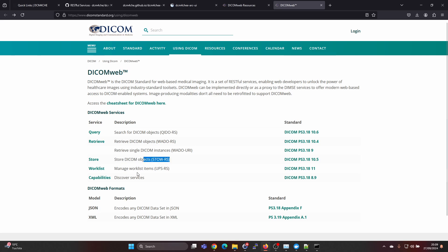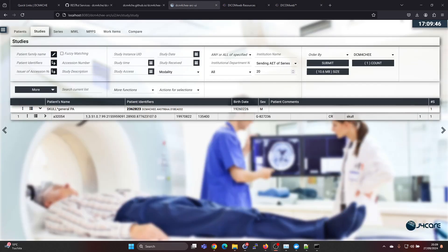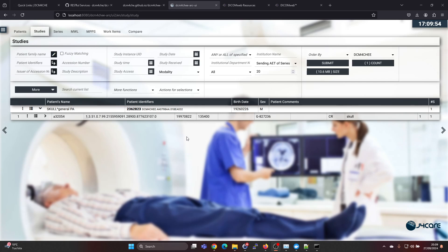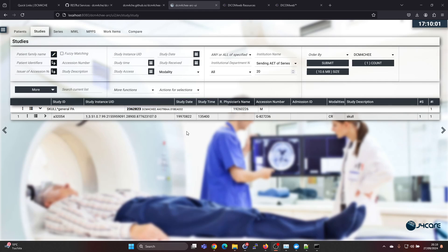You also have some other services like UPS for worklists. The easiest way for testing the DicomWeb services and understanding better how they work is to have a Dicom server or Dicom archive supporting the DicomWeb standard.